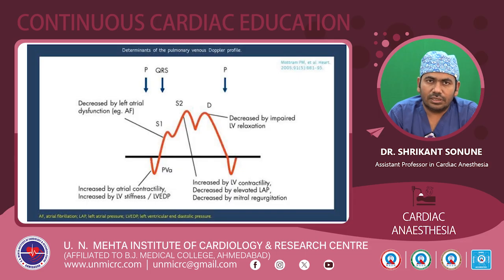The S2 wave can be increased by an increase in LV contractility and decreased by an increase in the LA pressure. There is a decrease in the D wave amplitude, which can be seen if the patient has diastolic dysfunction or impaired LV relaxation.